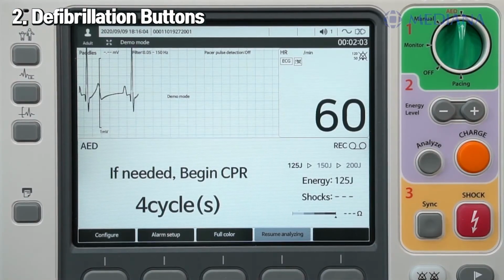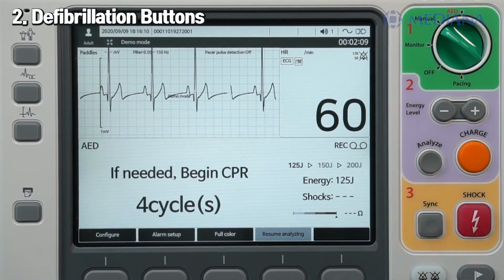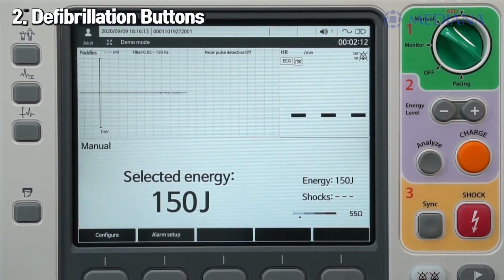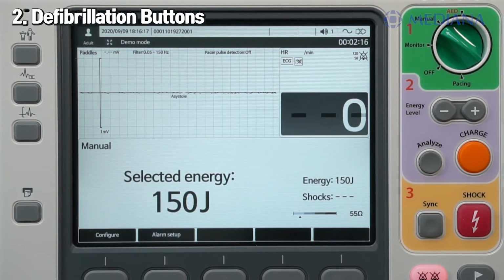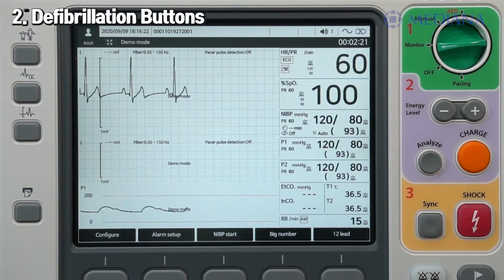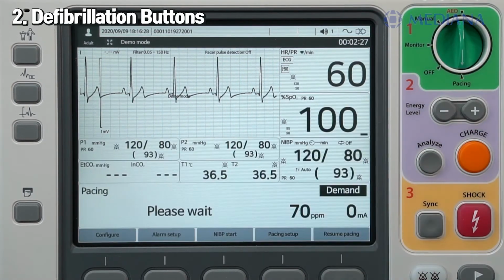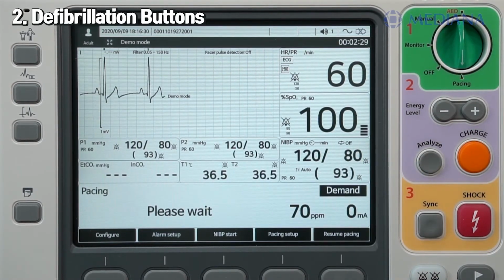Lastly, this grayscale setting applies to every mode. The user may change the color filter setting. By default, the screen is set to color, but it can also be set to black and white mode. When the device is used outdoors, visibility may be reduced due to strong external light. Therefore, if you change the display setting to grayscale mode, you can switch the screen to black and white, which makes the visibility better than color and improves user convenience.